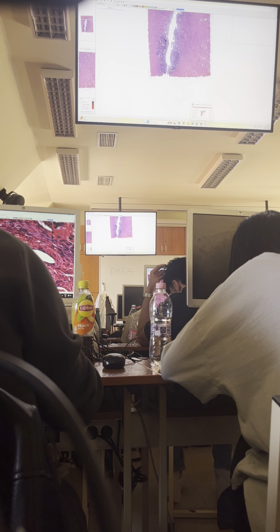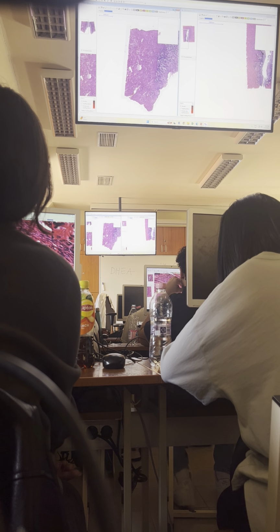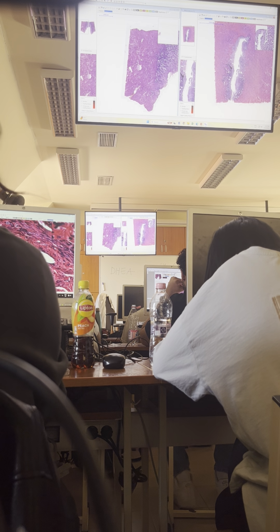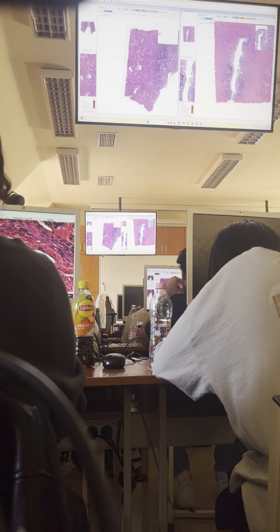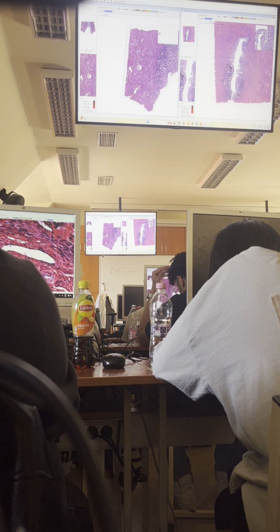Now, let's look at the other version. So during this time, what we have seen, the thickness of the endometrium is increasing. The minimum is about 2 millimeters, and it will reach something like 8 millimeters or even more when it is the thickest.